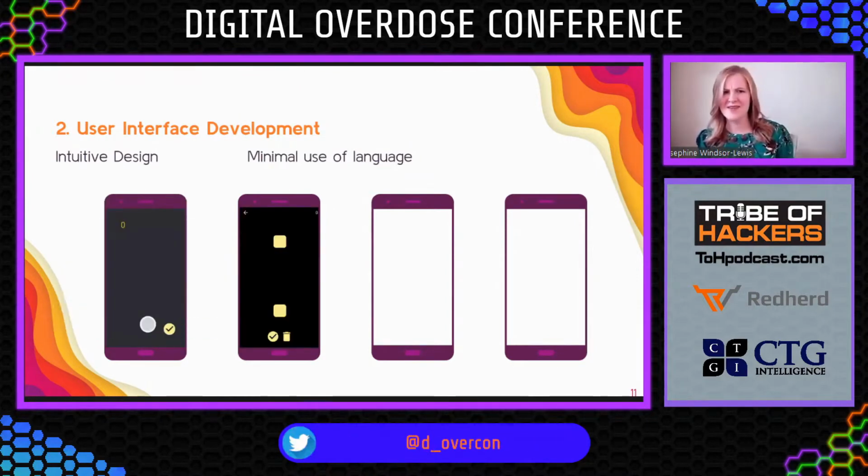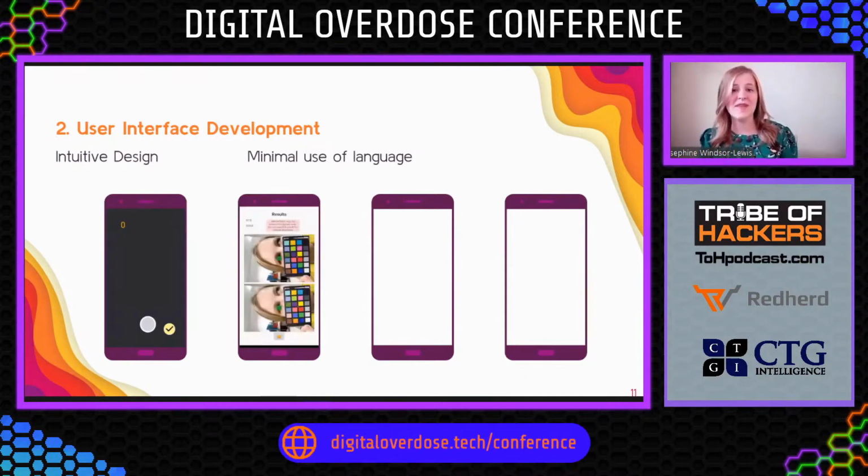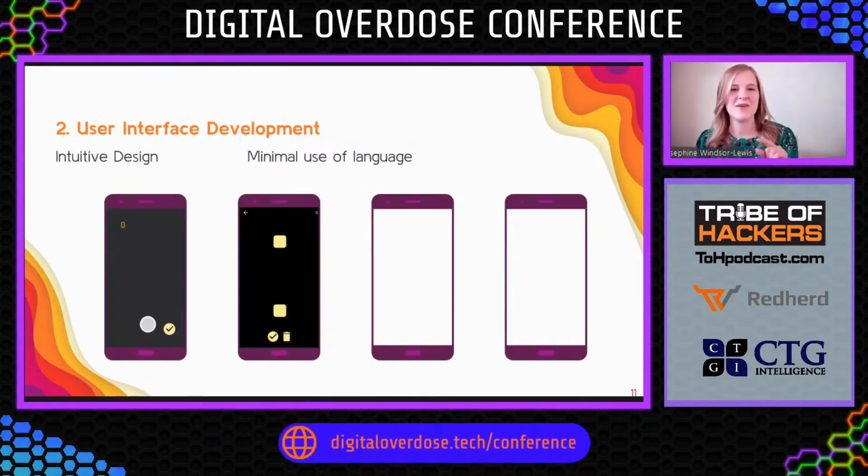After that, you're shown this screen. Now, this can look a little confusing, so I'll walk you through it. What you're seeing here is actually two images, one on top of the other. Kind of looks like that in real life. And a square in the middle. It's clearer on the screen. So that yellow square you see in the middle is the sample area.